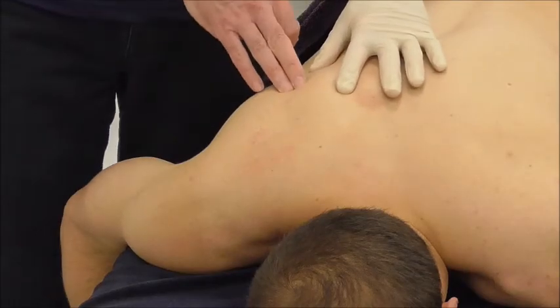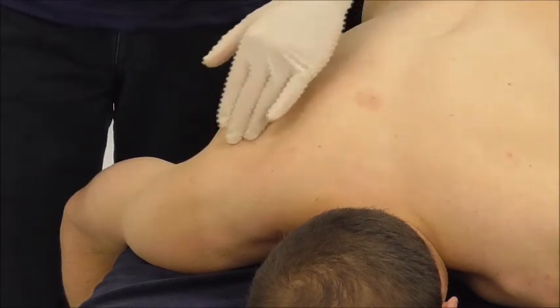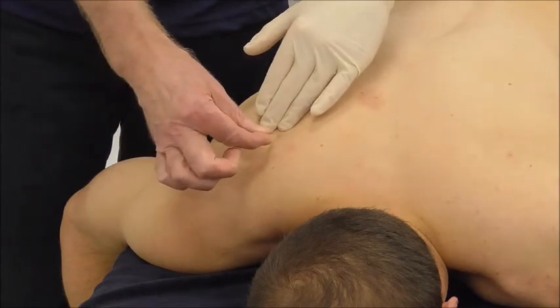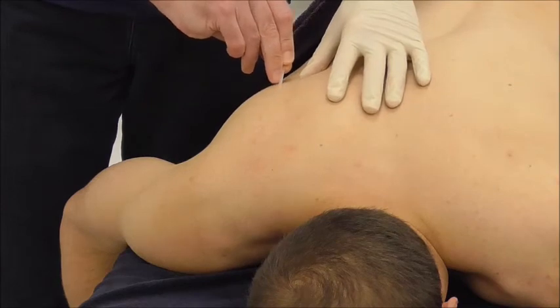When we come to the infraspinatus, the technique is exactly the same. Whereas with the supraspinatus we angle towards the spine of the scapula in one direction, for the infraspinatus we would angle the other way towards the spine of the scapula.